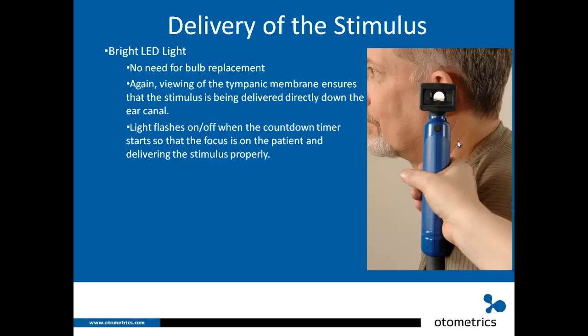You can make sure the delivery head is properly positioned in the ear, look through to confirm you can see the eardrum, click — and the light flashes to tell you the countdown timer has turned on. You don't have to turn around or look at the unit to see if the timer is working, which would risk moving the speculum out of position. We added the flashing light to give you feedback that the unit has made connection between the delivery head and the device.